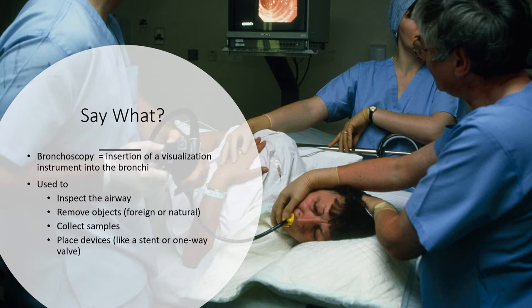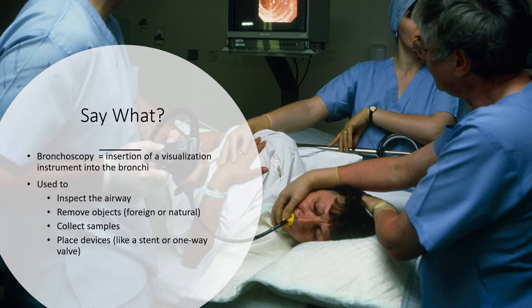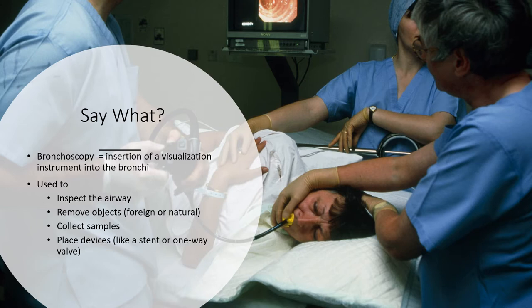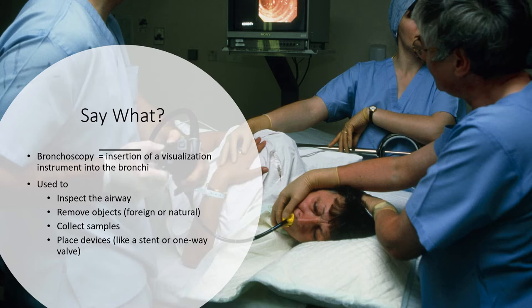We can collect a number of different samples. If we're looking for lung cancer, we can do an EBUS — an endobronchial ultrasound — where we use an ultrasound and drill a hole into lymph tissue. We get that sample, put it onto a slide, and hand it to the pathologist in the room. There are a lot of different types of samples we can collect.